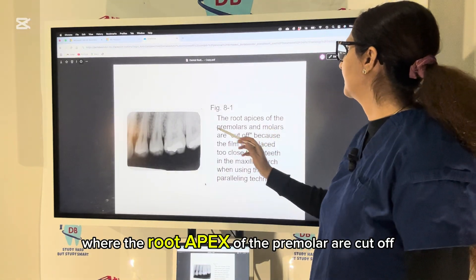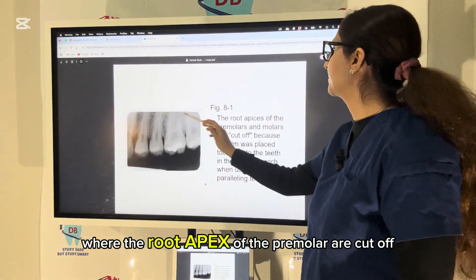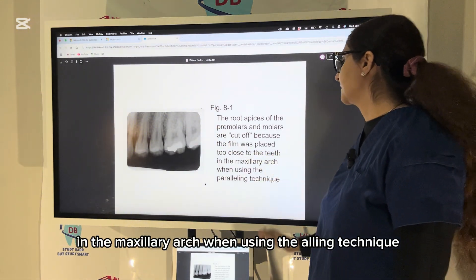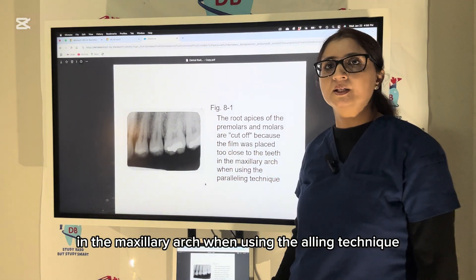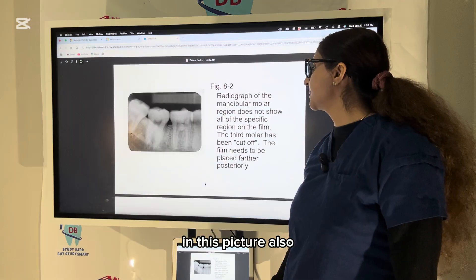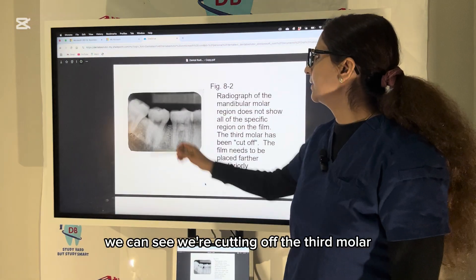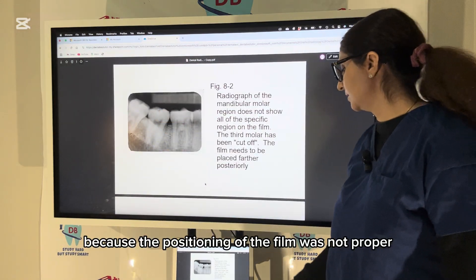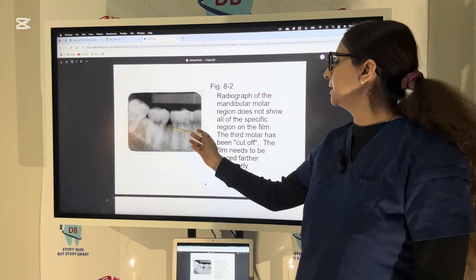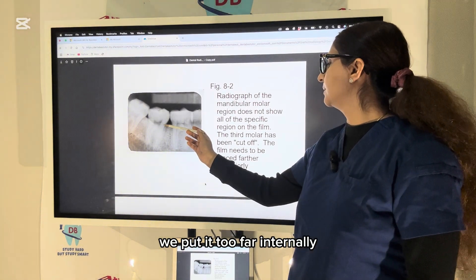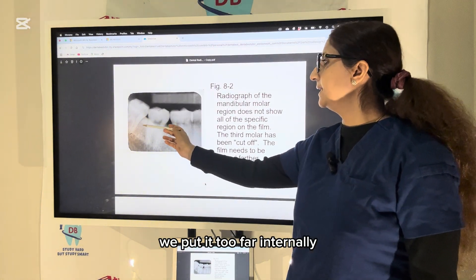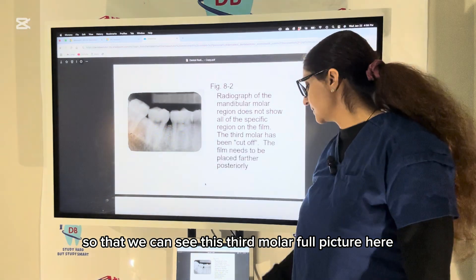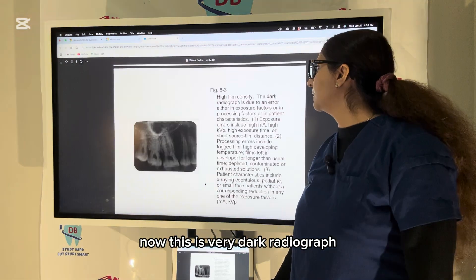Here we can see a radiographic error where the root apices of the premolars are cut off because the film was placed too close to the teeth in the maxillary arch when using the paralleling technique. In this picture also, we are cutting off the third molar because the positioning of the film was not proper — it was placed too far anteriorly. We have to shift it more posteriorly to see the full third molar.